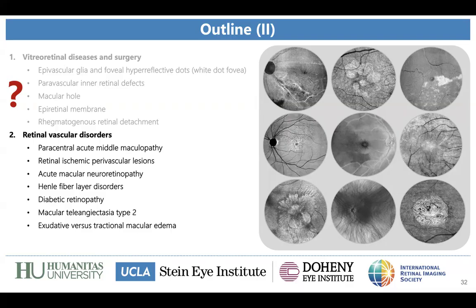Absolutely. Thanks so much, Luis. This is a very important point. I was actually unsure whether to include these slides or not, but for time reasons, I just skipped them. But maybe next time we could discuss them. So, of course, en face is fundamental also in longitudinal monitoring of macular hole and the epiretinal membrane after surgery. I think also, to reply to your question, en face OCT will be more and more used to classify these types of diseases, because as you were saying, by only using cross-sectional OCT, we actually miss some information.